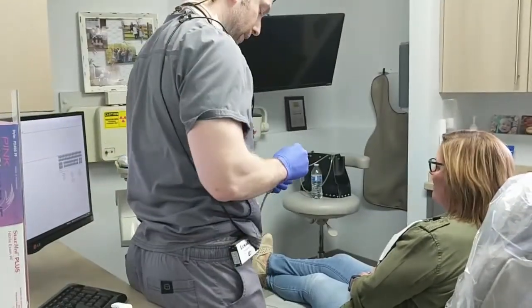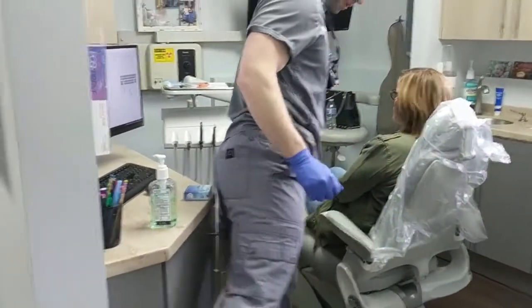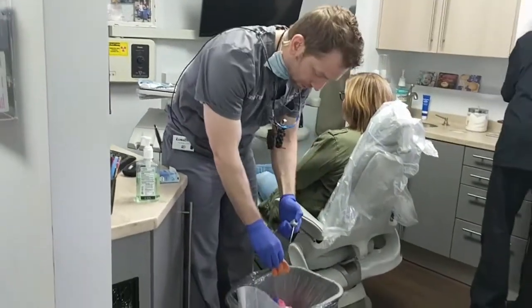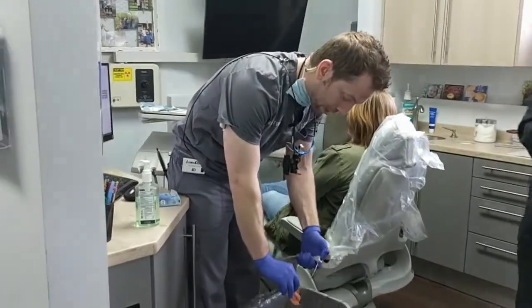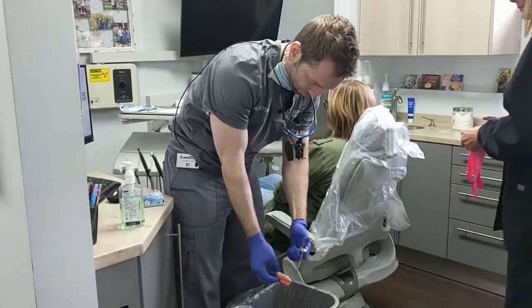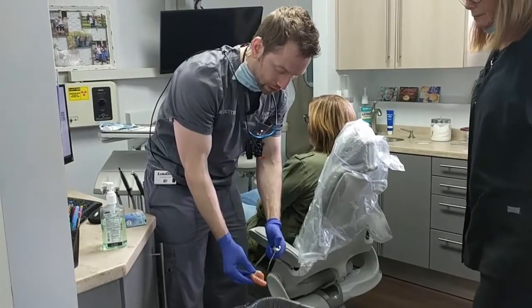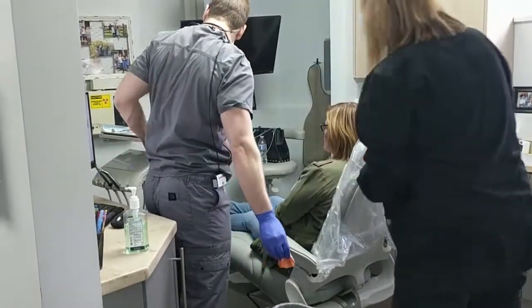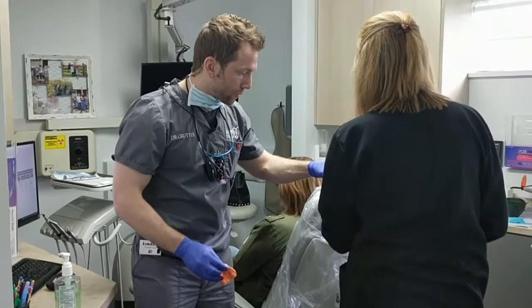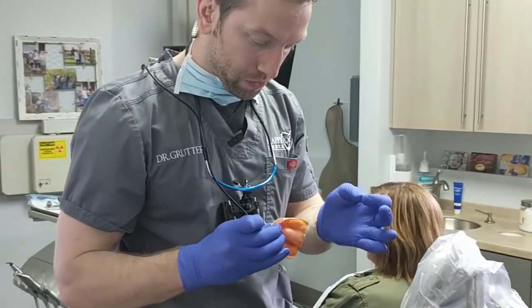I'm going to just rinse this off quick. I like to put five stickers at least on the buccal and lingual. And you can already see one. The reality is, these stickers don't stick really well — they will fall off if you're not careful, so I make sure the denture is very dry.